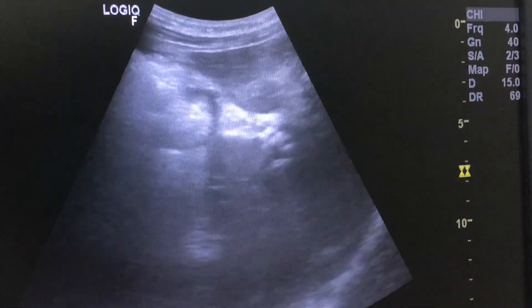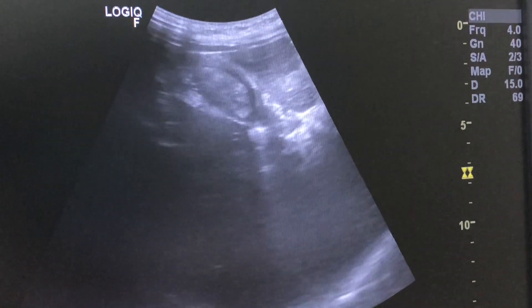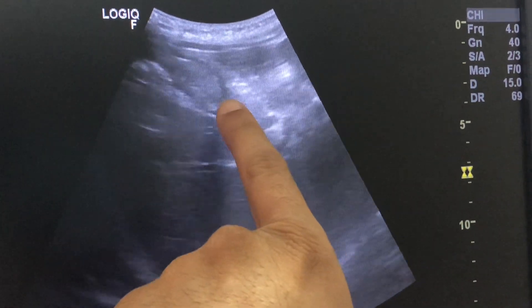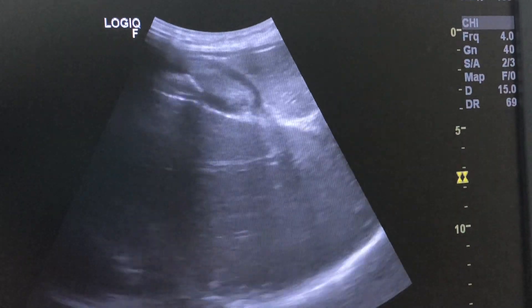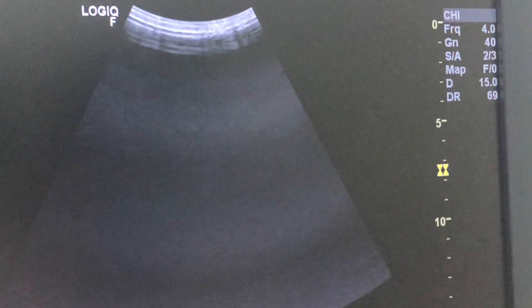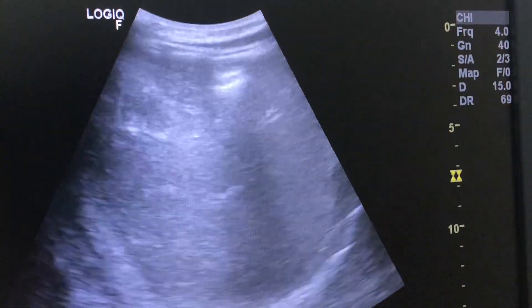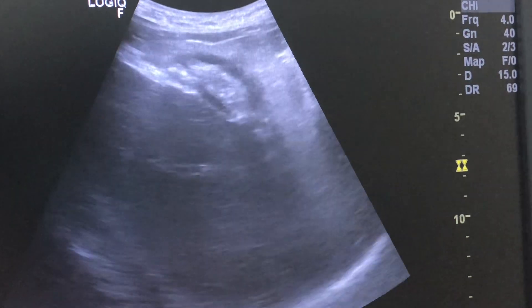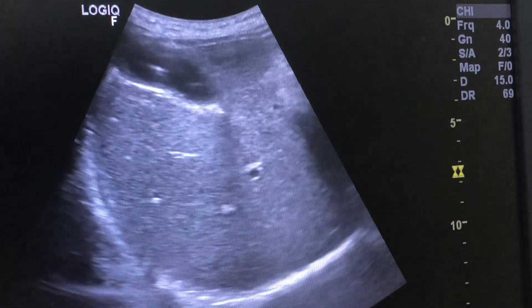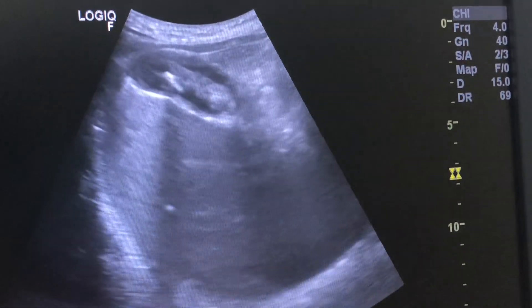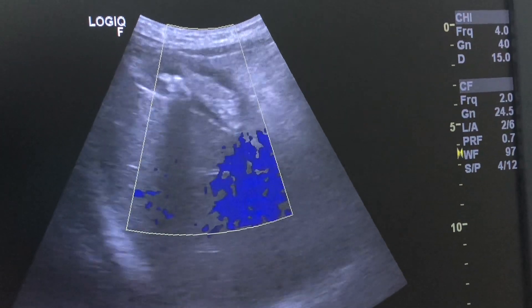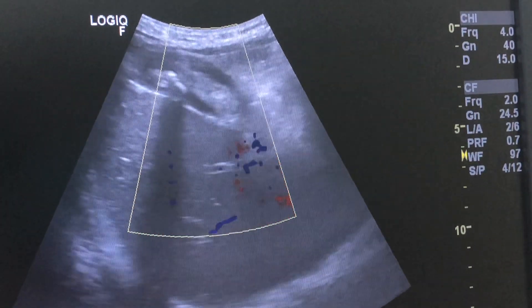Liver is normal and there is some large sludge in this gallbladder. It could be a gallbladder mass — a biliary mass also. We cannot say for sure because there is associated some mass in this right kidney.